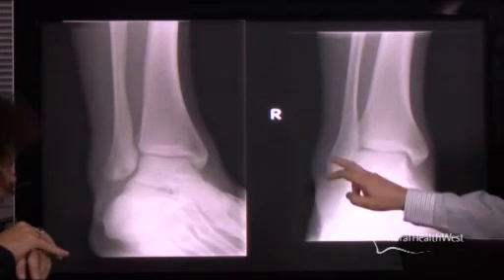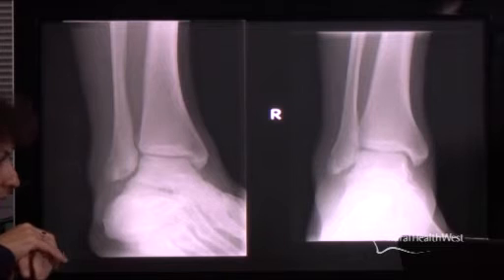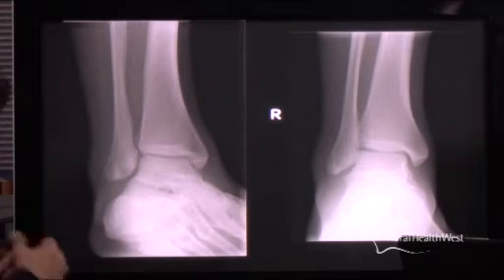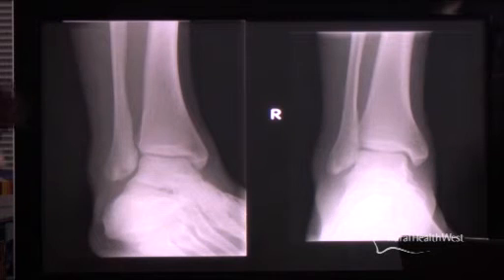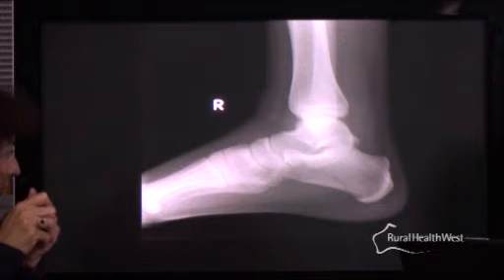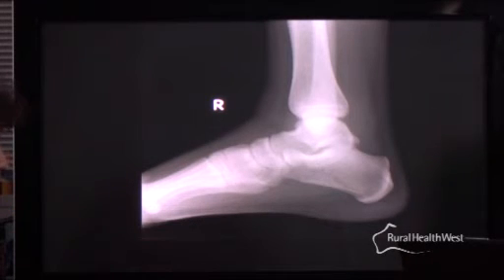So Rodney, getting back to my basketballer, who could, I guess, have had any of these things, could you just talk me through what he actually did have? Right. So on the radiographs, on the AP and oblique views, you can see there's quite a lot of soft tissue swelling adjacent to the lateral malleolus, and that we often associate with injury to the collateral ligaments. There's no evidence on this of fracture involving the malleoli, nor is there an osteochondral injury involving the dome of the talus. When we go to the lateral, we see this finding again of quite a large hemarthrosis, and that would start to ring alarm bells that there is something more going on, because we haven't really seen a fracture in this case.